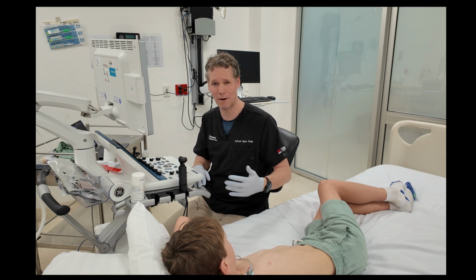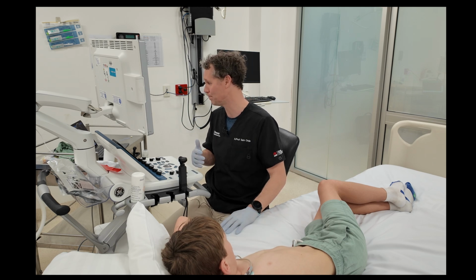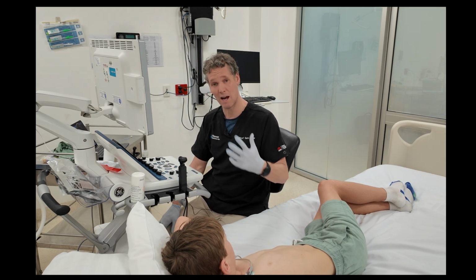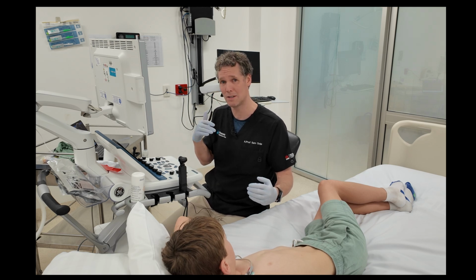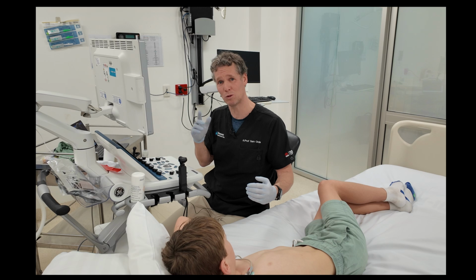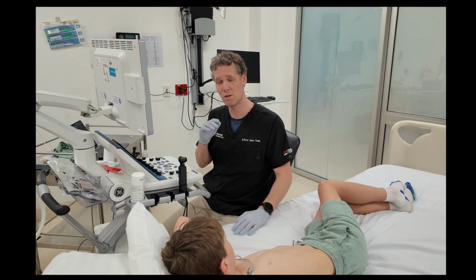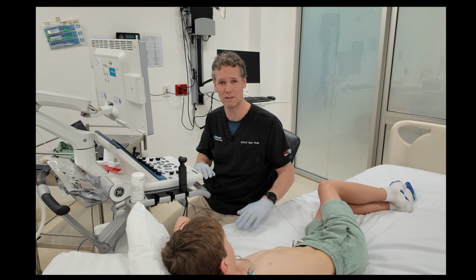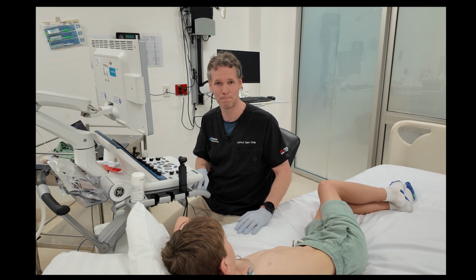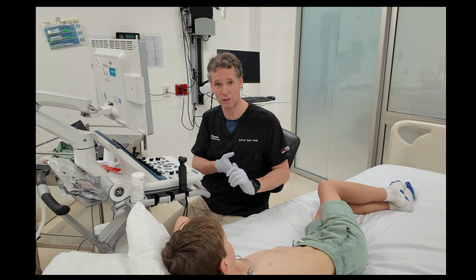And it normally takes about 15 to 20 studies for you to be able to figure out how to do that. What we're going to show in this video is how to take those images. But once you've taken that, you've got to be able to interpret those images. And you don't make assessments based on one view alone. You use as many views as you can. Once you've made that assessment, you're then going to have to integrate that assessment into the clinical management of that patient. And each one of those stages takes a little bit more time to learn. So we'll go through a few tips and tricks on how to do the scan.